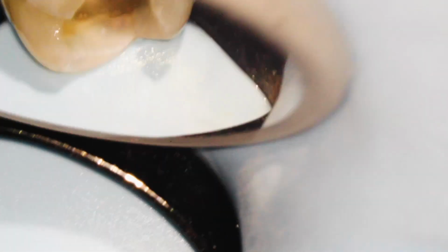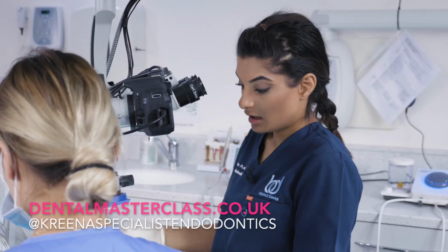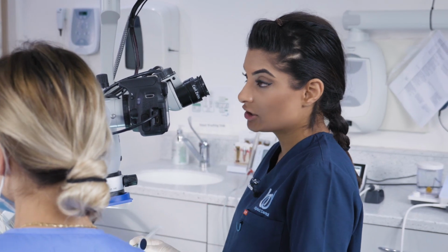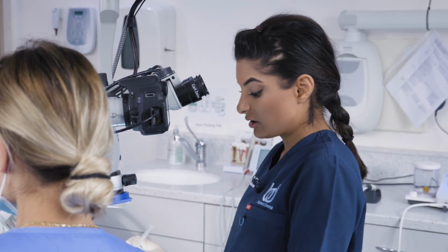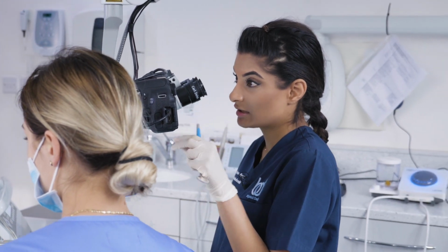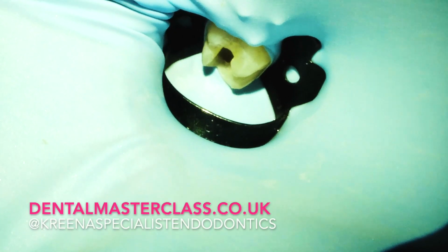So we call it a pre-endodontic restoration. And I used to think it took a lot of time initially during treatment, but actually we now know, afterwards it's just a very small occlusal filling that you're doing. So although you spend more time initially, you save time at the end.